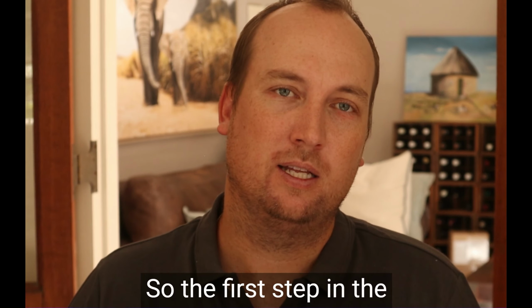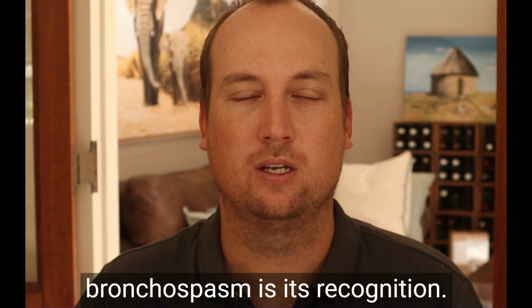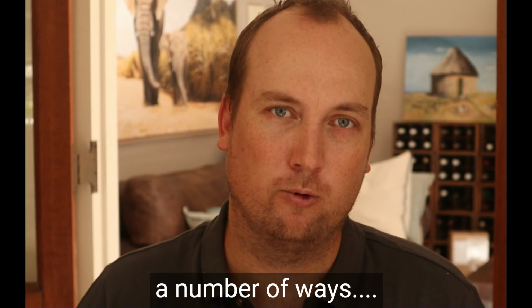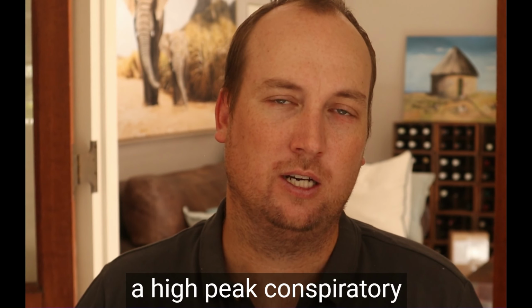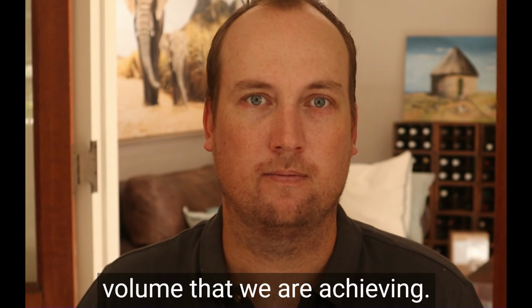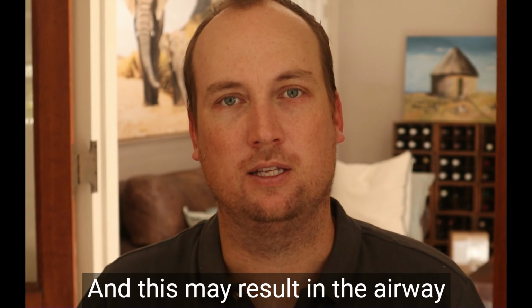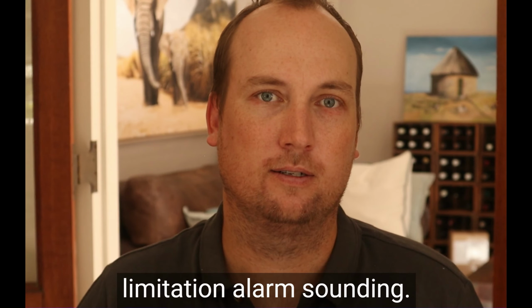So the first step in the management of intraoperative bronchospasm is its recognition. And we recognize it in a number of ways. First of all, there might be a high peak inspiratory pressure relative to the tidal volume that we are achieving. And this may result in the airway pressure alarm or a pressure limitation alarm sounding.